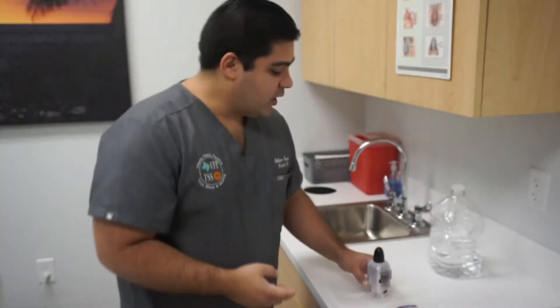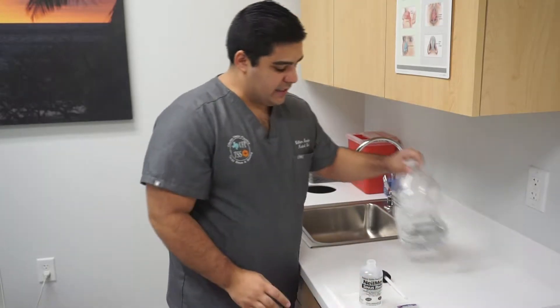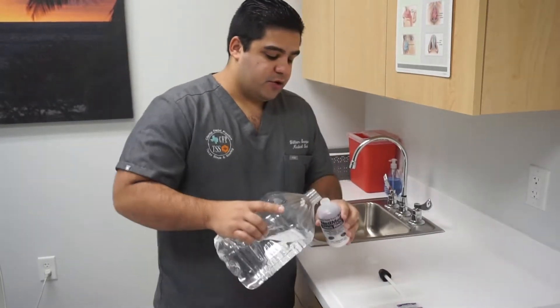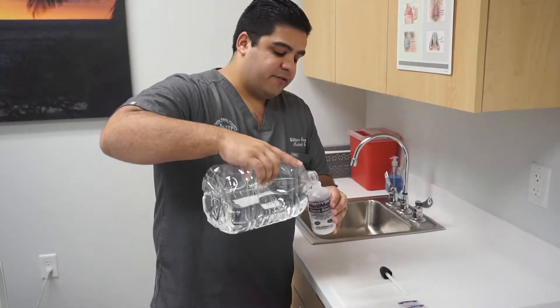Using sterile water, what you will want to do is take off the cap and just lay it on a paper towel to keep it clean. Then you are going to pour the sterile water all the way up to that fill line.